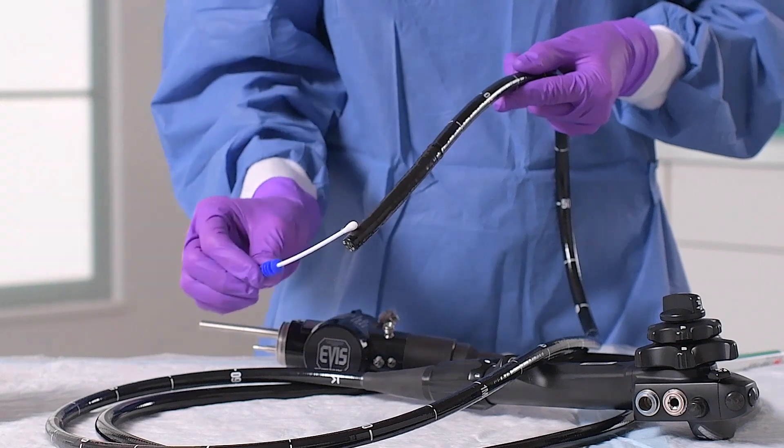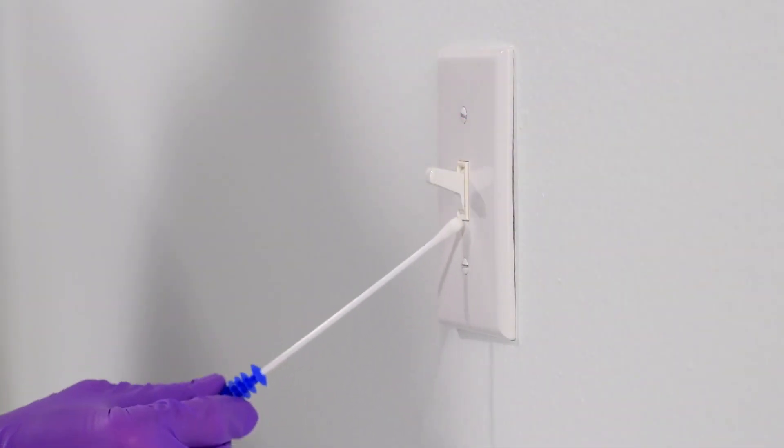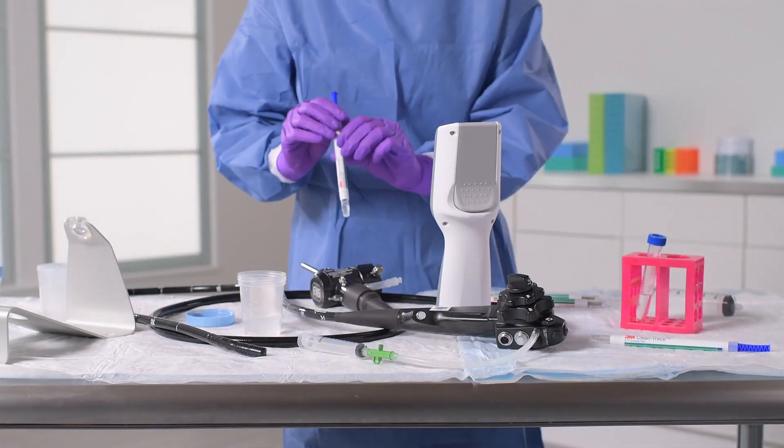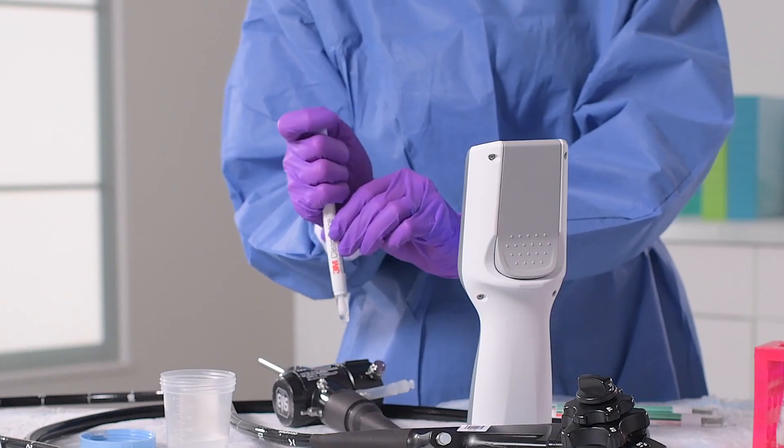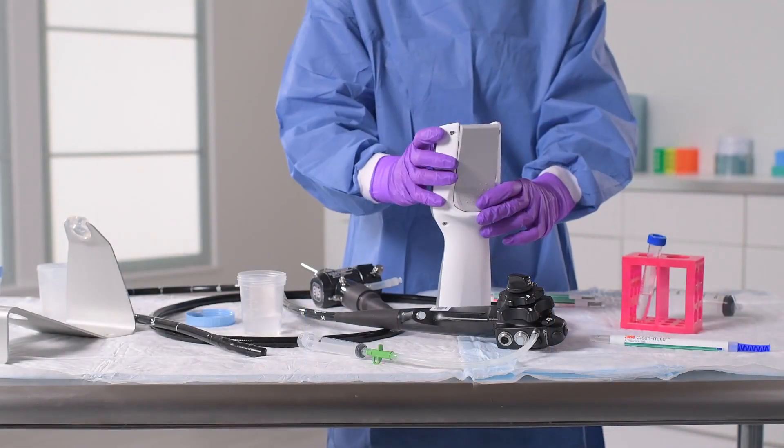To measure ATP levels, start with collecting your sample with the CleanTrace surface or water test. Activate the ATP test by inserting into the device sleeve and shaking side to side. Then, insert into the Luminometer.